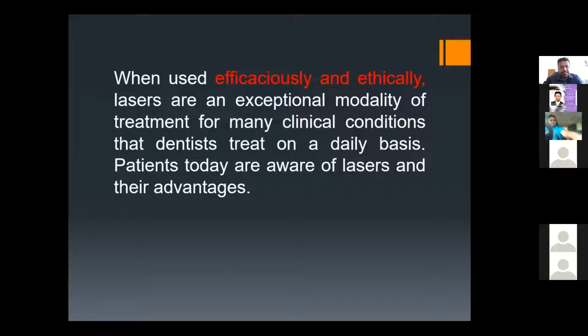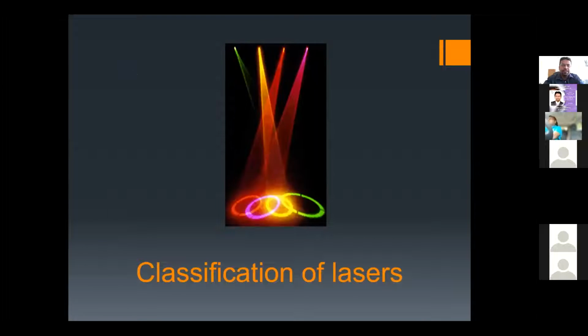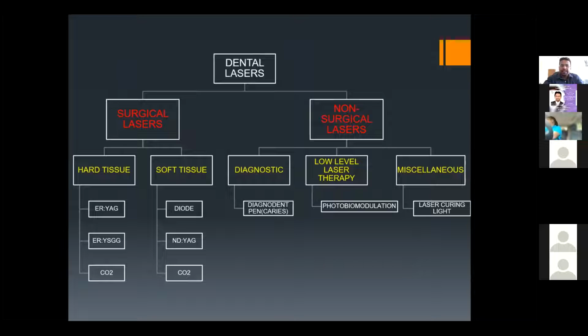So in such cases, you should have an option of lasers in your clinic. Okay, so let's see the classification of lasers. The dental lasers are classified into surgical lasers and non-surgical lasers. Now, surgical lasers are classified into hard tissue lasers and soft tissue lasers.